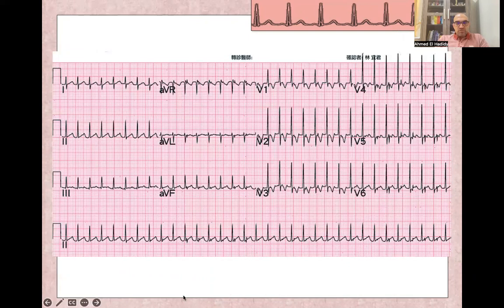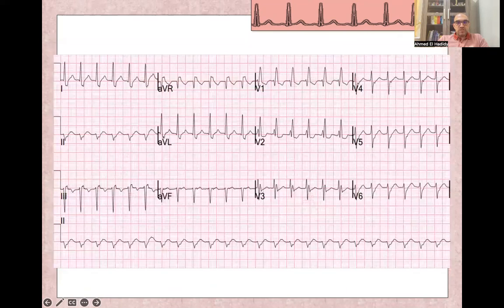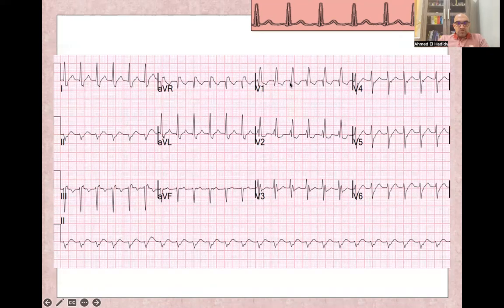This is supraventricular tachycardia — SVT. As you can see, it is a narrow complex tachycardia with a rate of almost 180 beats per minute. No P-wave is visible, and it is regular. Here you can see slight ST depression and T-wave inversion, even without coronary artery disease. Here is another example with right bundle branch block morphology and wide complex because of aberrancy.